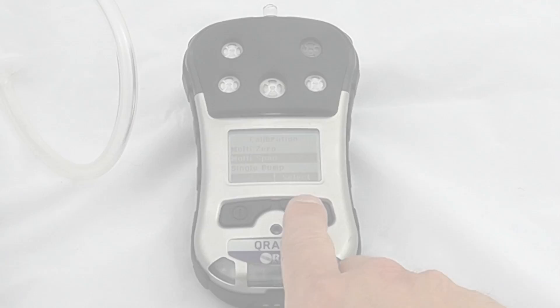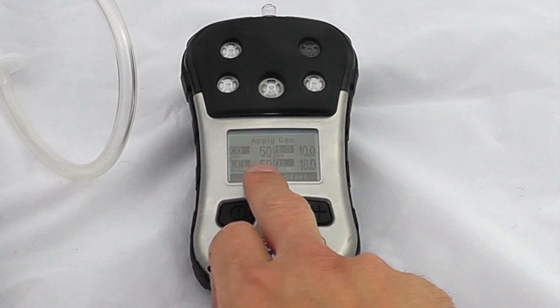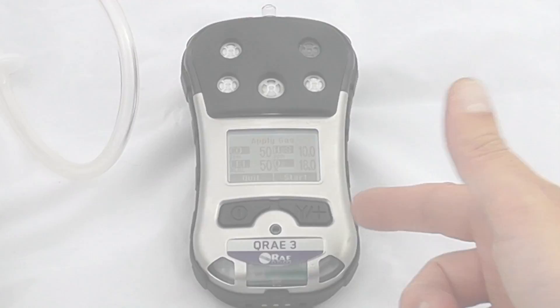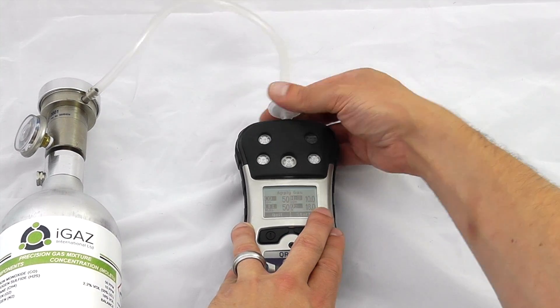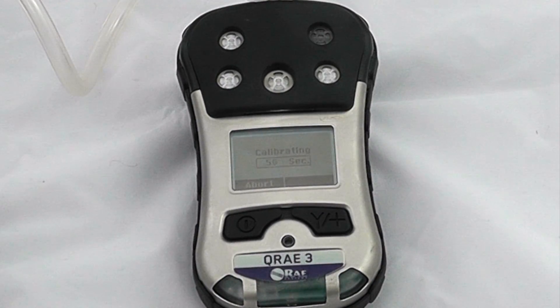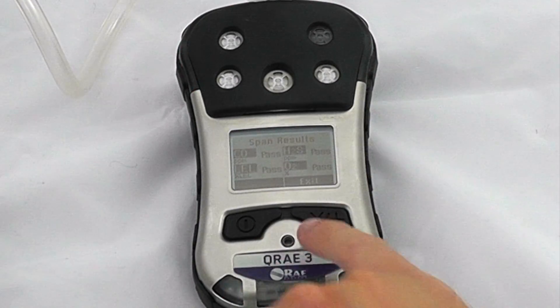We'll start the multi-span. It's letting us know what gas types we've got, so please confirm that these match your gas bottle. You can manually start, but if you have an on-demand regulator or gas applied, this will automatically start the calibration when it detects gas flowing over the sensors. It's a 60-second countdown, and at the end we'll know if the calibration has passed or failed. Our cal readings are where they should be — it has now passed calibration.